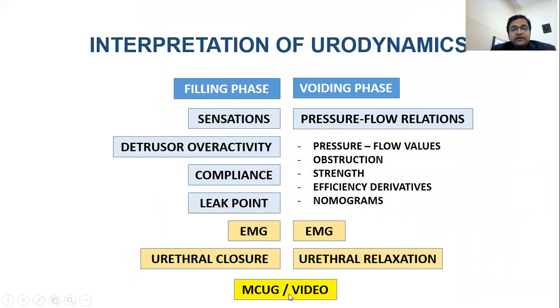Then in children, we should most of the time combine the urodynamics with either a video if we have it available, or even an MCUG done separately is sufficient.